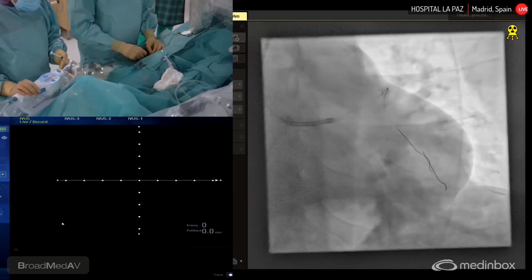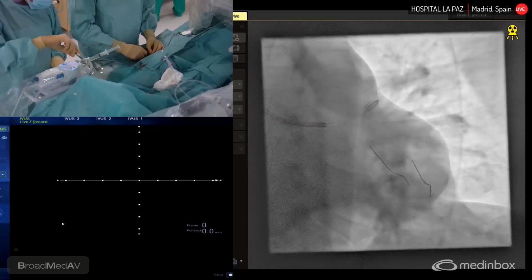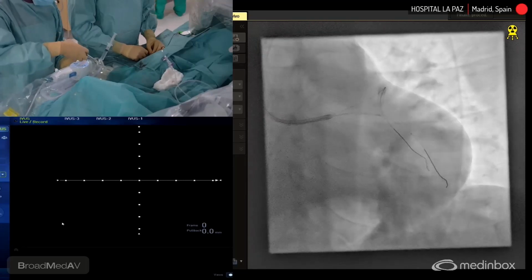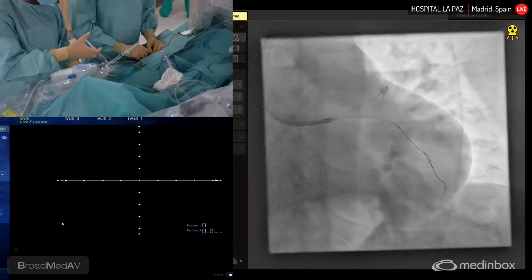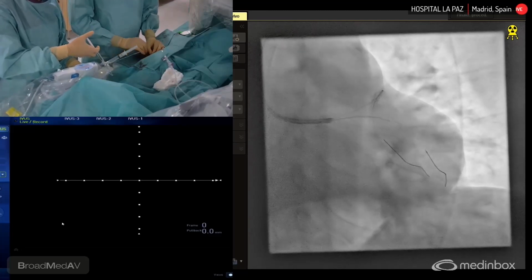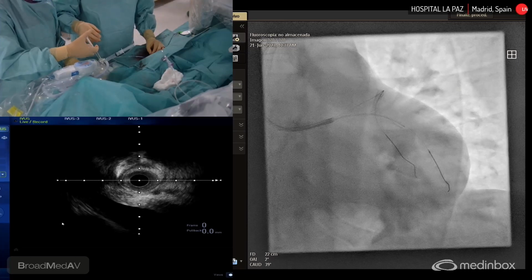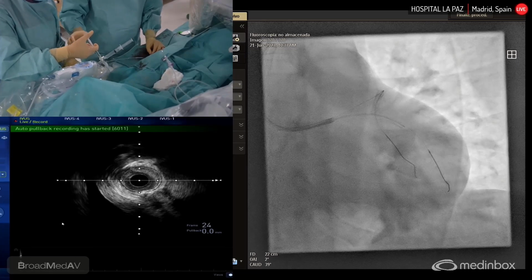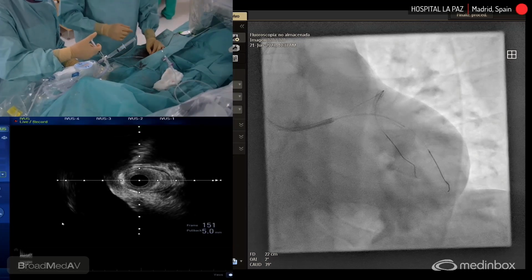Another possible question is if the patient could be a good candidate for CABG, but in this case, the distal LAD is quite diseased. Also, the right coronary artery. The good vessel for CABG could be the intermedius branch, but only for this vessel, I think it's more reasonable to go for a PCI, and you always have time to put a graft in the distal LAD.